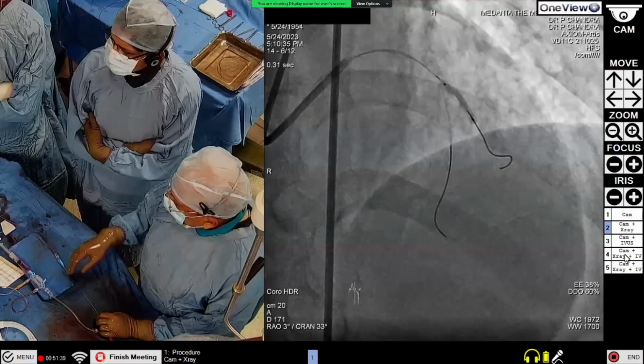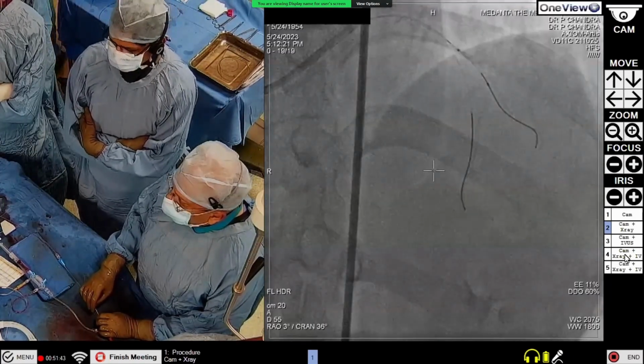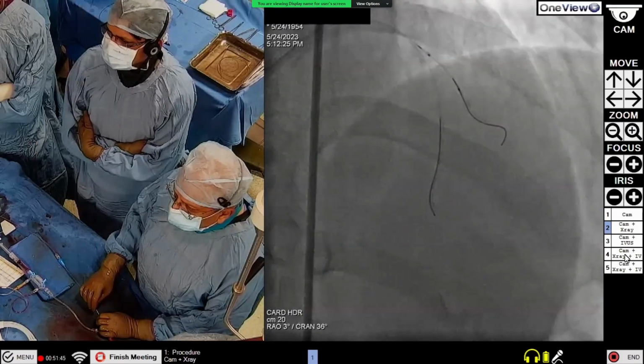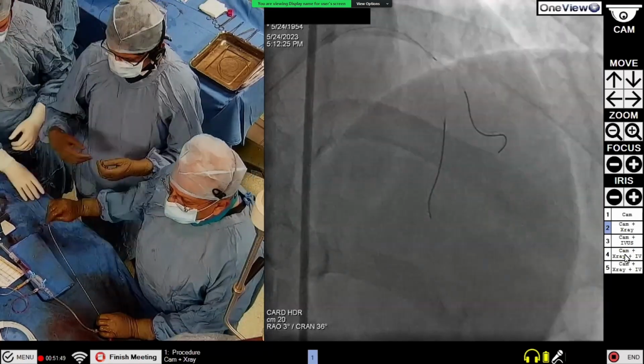Okay. Deflate. Deflate. 1 minute 48 seconds. Deflate now. Okay.